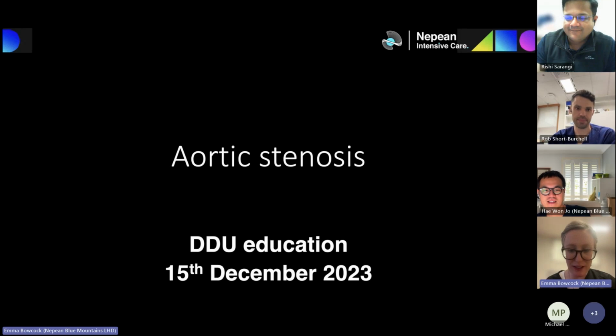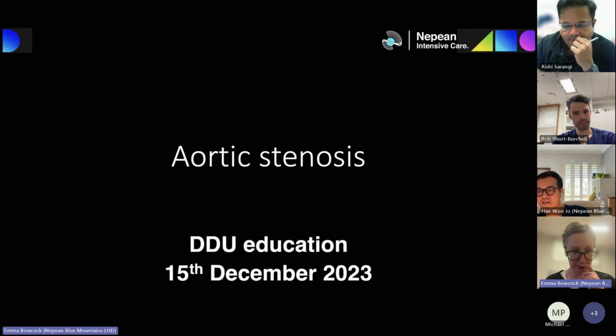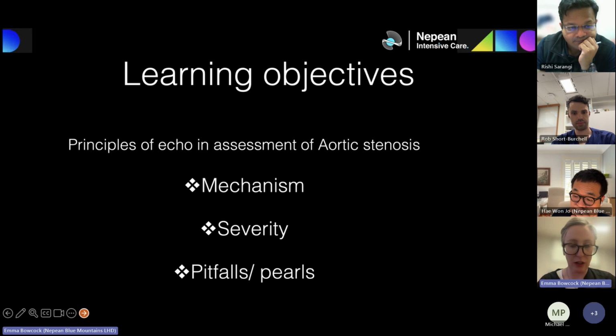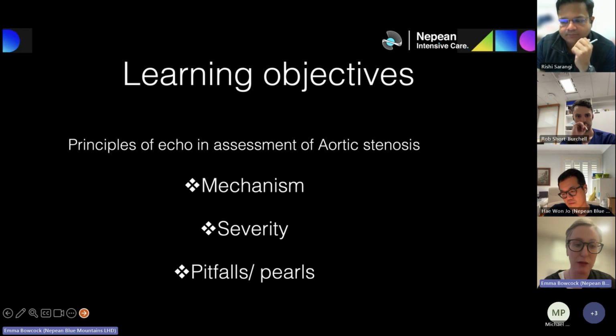Right, welcome everyone. This week we'll talk about aortic stenosis. We'll try and keep it as interactive as possible. See how we go. So we'll look at the principles of echo assessment in aortic stenosis, talk through a little bit about mechanism, of course, severity, and some pearls and pitfalls. And we'll have some cases. We'll ask some questions as we go through and then have some cases at the end, hopefully 2 to 3 cases.